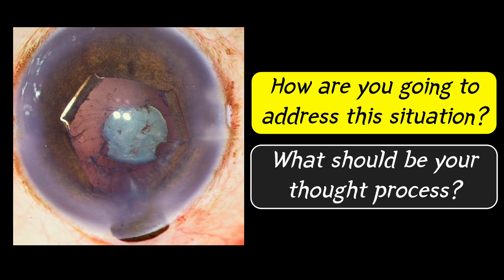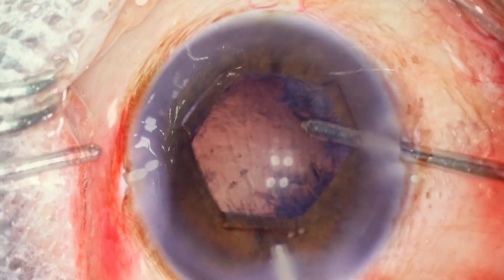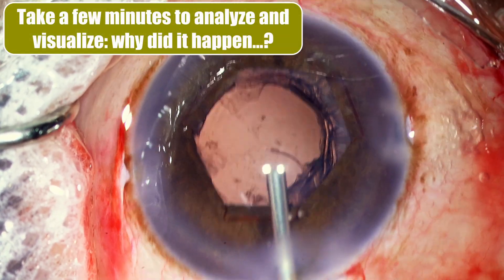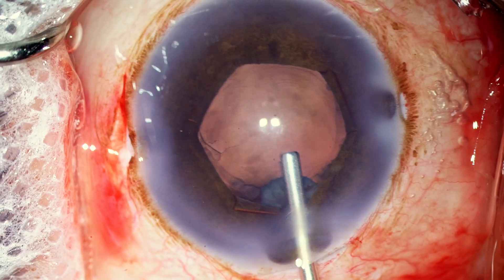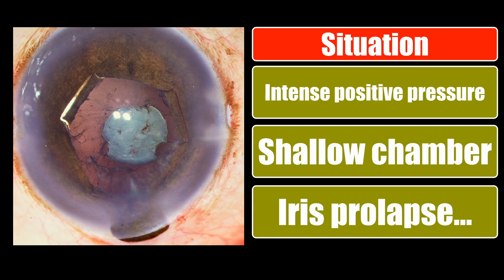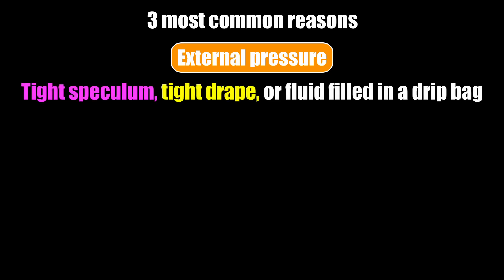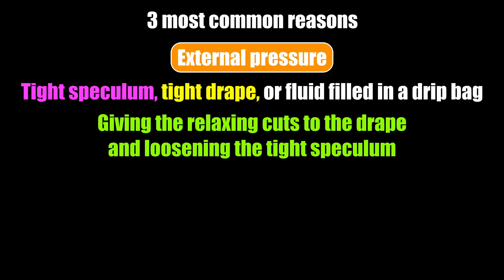I assume you've noted down your observations. Whenever we have a difficult situation like this, the first thing is to buy yourself some time — push in OVD, come out, and take half a minute to analyze and visualize what things could be playing a role in creating the situation. We have intense positive pressure, the chamber is shallowing, there is a little iris prolapse, there is no space in the anterior chamber. Let's write down the three most common reasons for such intense positive pressure. The most common obvious one is external pressure on the globe — a tight speculum, tight drape, or a drape bag filled with fluid squeezing the eyeball. Just ensure these external factors are taken care of: give a relaxing cut to the drape or loosen the speculum. But obviously that was not the cause in this particular patient.